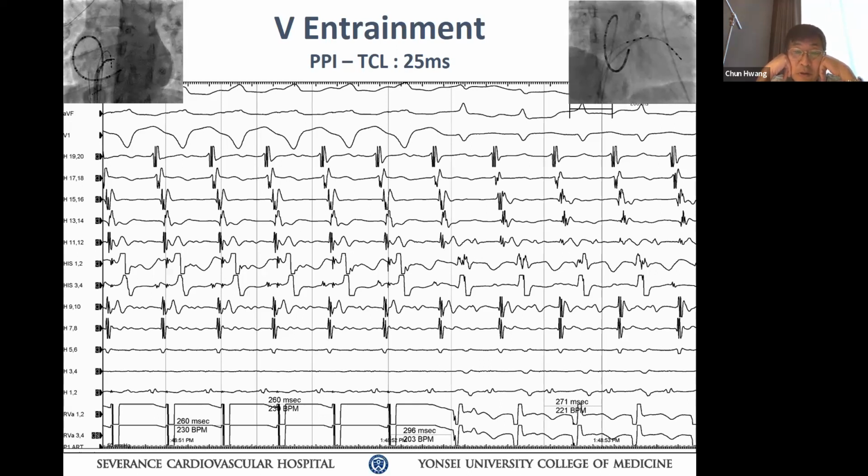Then you look for pathway potential very carefully, and this type of patient, I would do RB pace map one, also during the tachycardia pace map to see which one matches. 왜냐면은 tachycardia 할 때가 RB pacing 할 때 completely different sometimes, especially this such a long pathway. 왜냐하면 during the tachycardia dominant conduction을 보여주는 거고, RB pacing은 first insertion pathway를 보여주는 거기 때문에 can have a huge difference in the area of ablation. Keep that in mind. Okay, those are tips I can give to you.